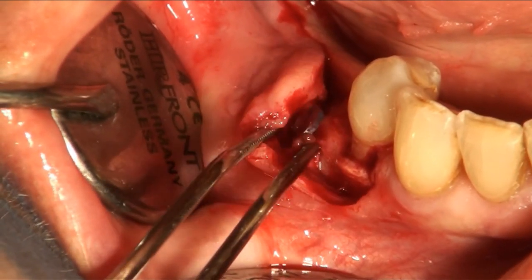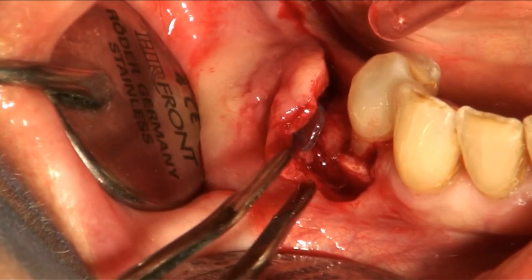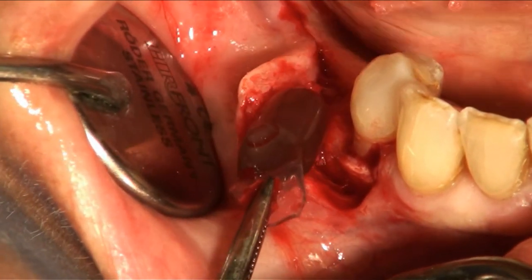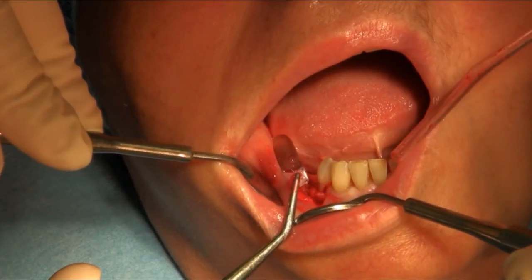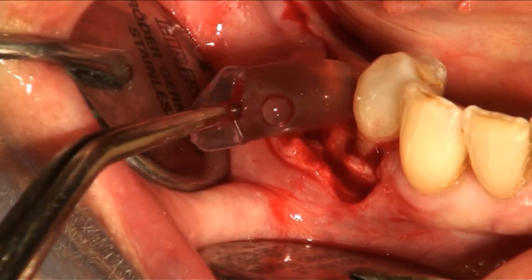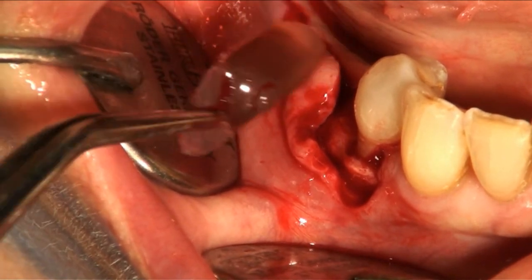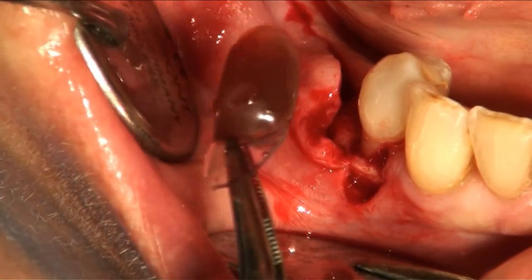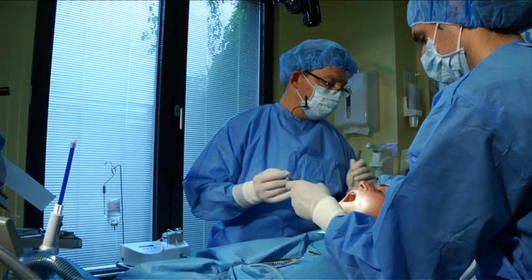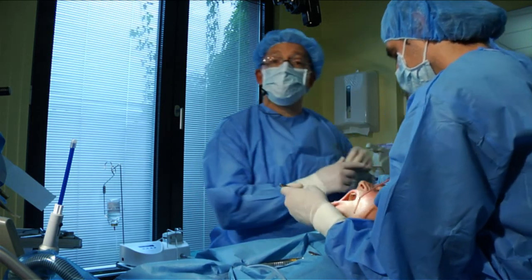And now I will remove this expander out of the pouch. It sticks there, quite sticky. And here we go. You see this expander is completely safe, so it is expanded in an optimal way, and still the outer silicone shield is around the capsule, so the function of this expander was ideal. Now we go ahead and prepare the flap.